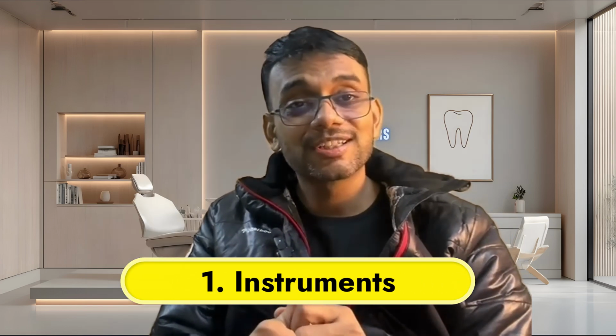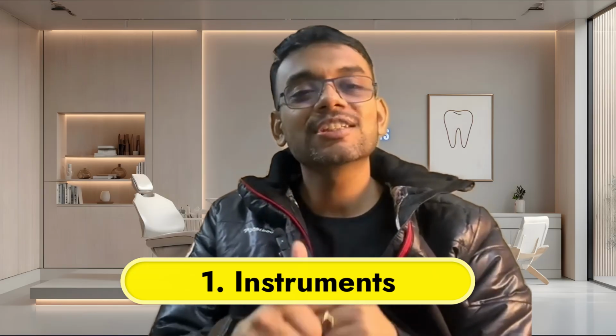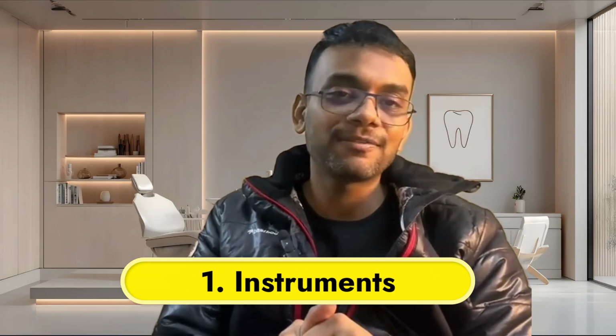Number one, instruments. We tend to use the same instrument 20 times, 25 times, 15 times because the company agent has told you, sir, ma'am, this instrument is going to last for like 20 RCTs. You can do it. Don't do that. Okay? Don't do that because every instrument has a fatigue.